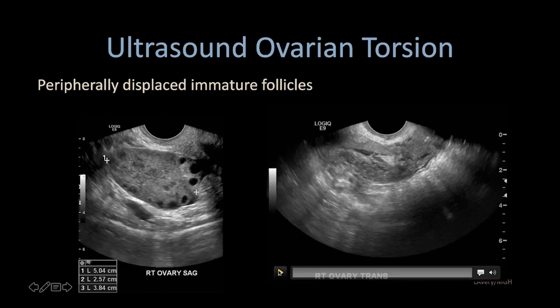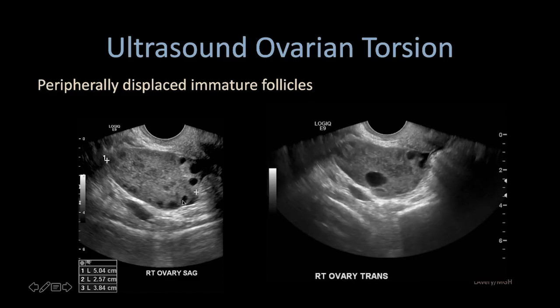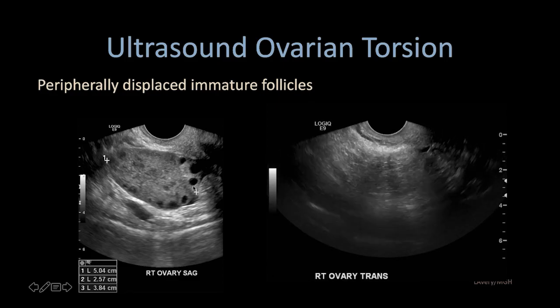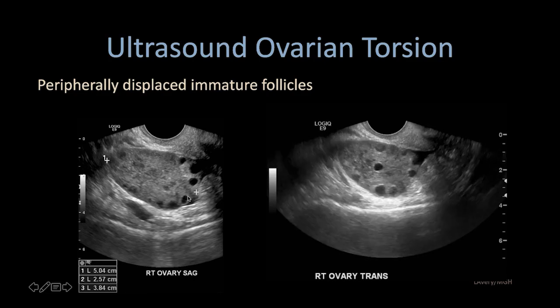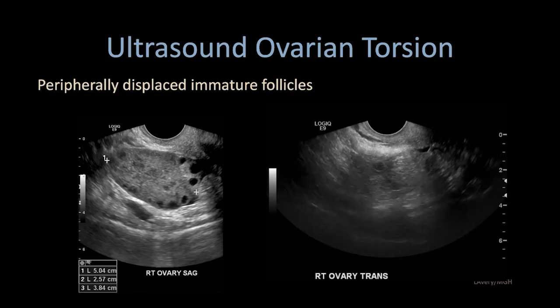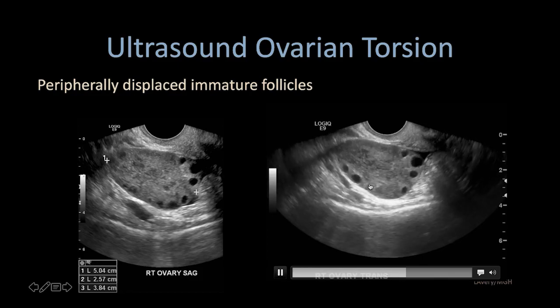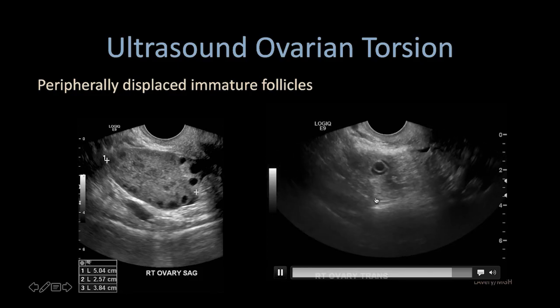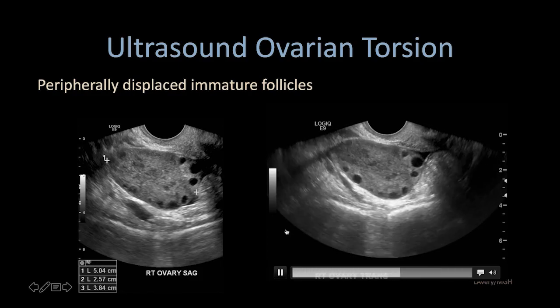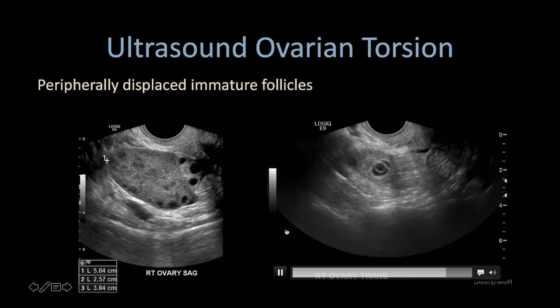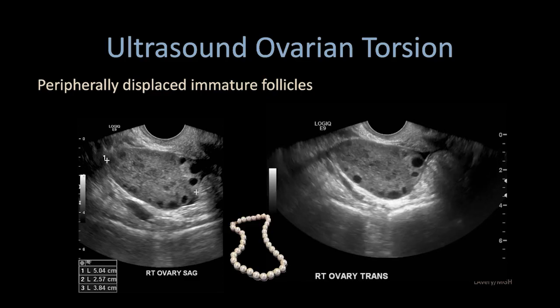Oftentimes there will be multiple tiny peripheral cysts within the ovaries. Frequently these cysts are homogeneous in size and considered immature in appearance. Here you can see on this sweep image of the ovary multiple small cysts — this is oftentimes referred to as the string of pearls sign of the ovary.